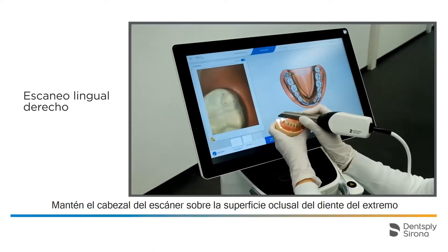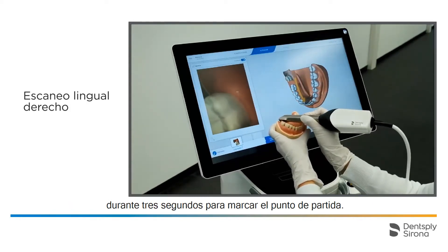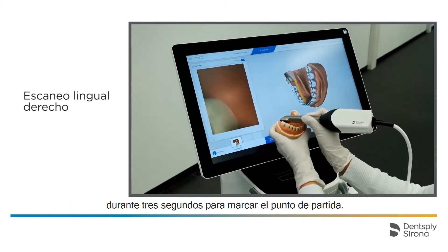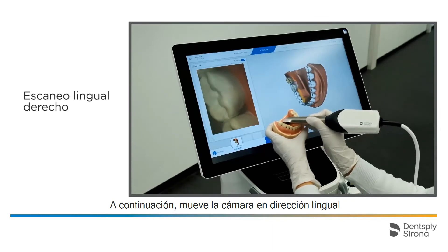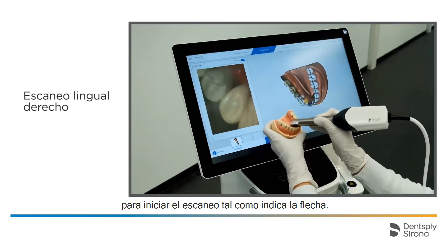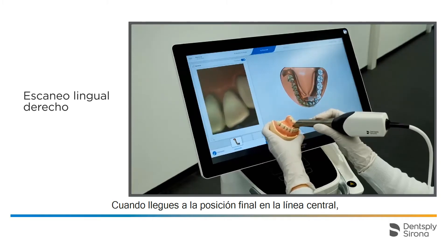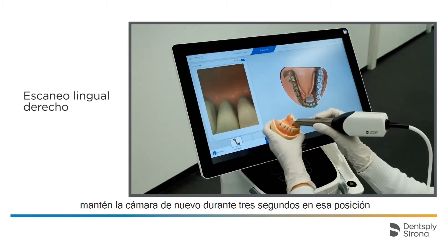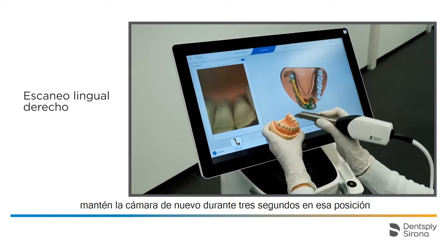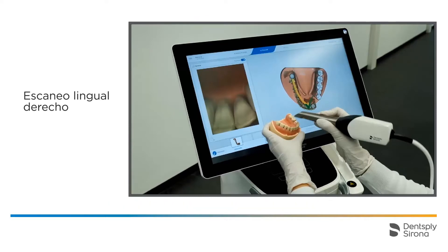Keep the scanner head on the occlusal surface of the end tooth for 3 seconds to mark the starting point. Then move the camera in lingual direction to proceed with the scan as indicated by the arrow. When you reach the end position at the center line, hold the camera again for 3 seconds to determine the end point of the partial scan.